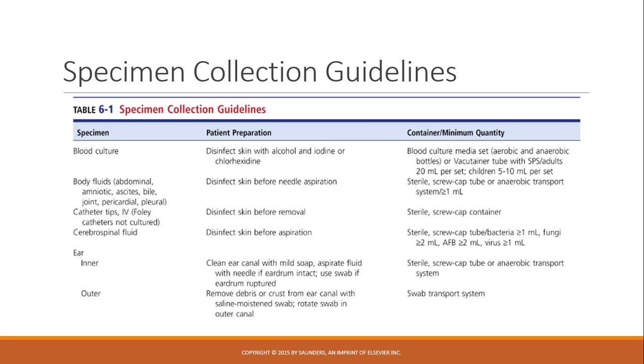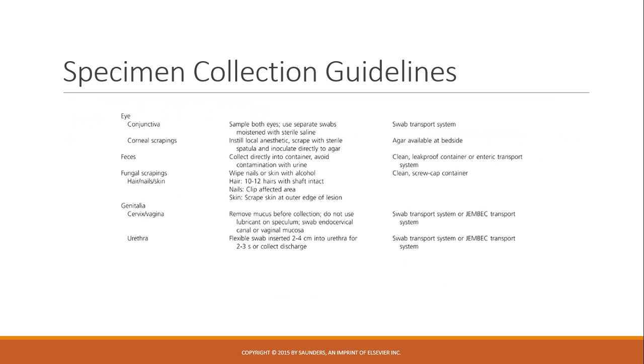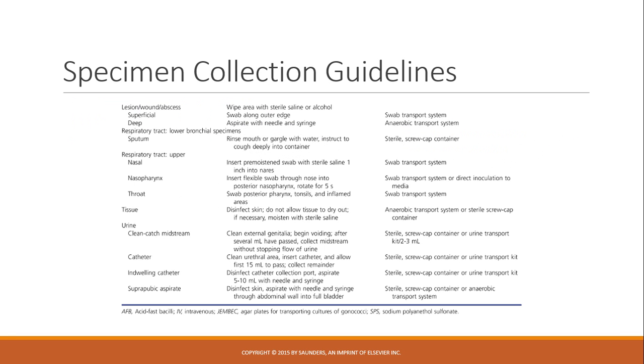So blood cultures are glass bottles that you would collect. When you're doing a venipuncture, instead of collecting a tube of blood, you collect this bottle of blood. The bottle has media in it, which will grow any kind of organism that's present. Then you stick it in an analyzer, and it can detect whether or not bacteria is present. It's a little more technical than that, and we'll talk about those again soon. So it's just examples of how to collect certain types of samples.